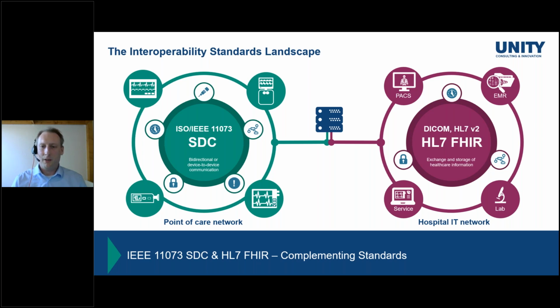And I think the good news is that there has already been a lot of work on how to build a bridge between the green circle and the red circle, between SDC and, for example, HL7 FHIR. It's ongoing work, but because they have been developed in parallel, there are many commonalities and you can easily transform the data between these two.